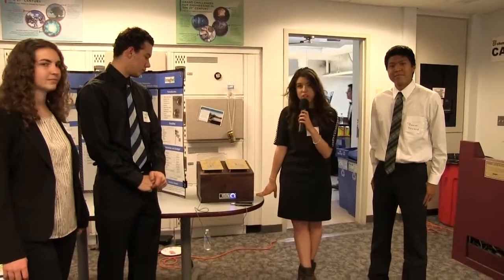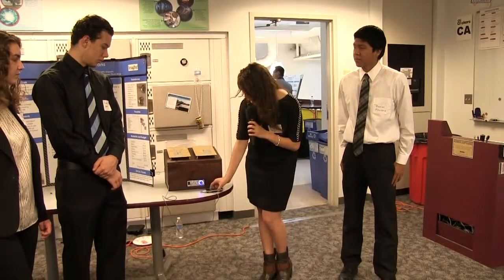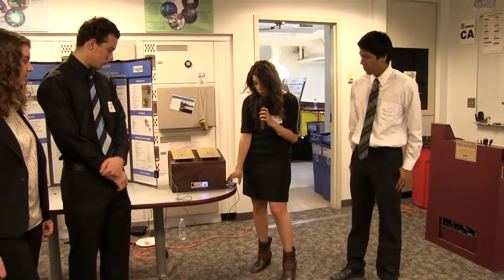Hi, so we're Opus 4 and our project is Innovative Vibrations, and essentially what we have here is a stationary product which transforms audio energy, electrical energy, into mechanical energy. So our client can feel the vibrations of music while being hard of hearing. So just giving them that opportunity to experience something a little bit out of their normality. So if we go ahead and start our external audio source.